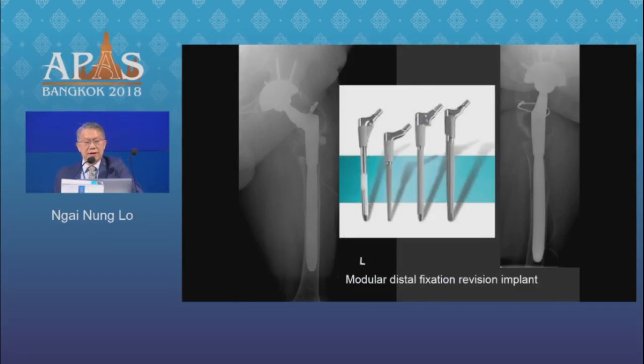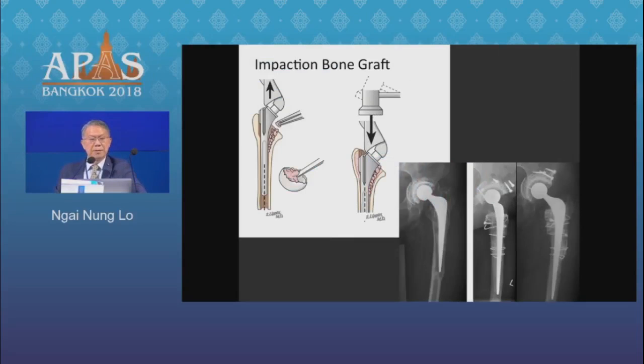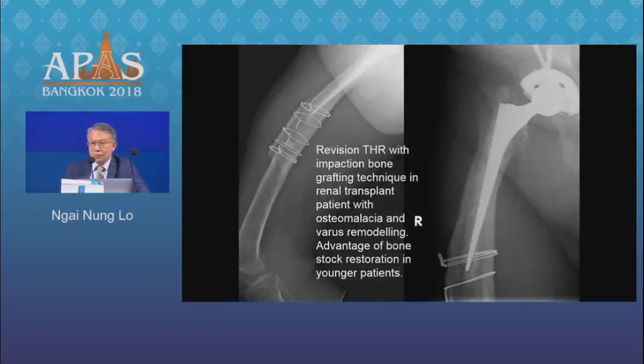So there are many variants of this. They come in scratch fit types, cylinder types. They come in modular fluted types, depending on the surgeon's choice. End of the day, the type 4s, by the time you reach type 4s, is really a tough call. And sometimes the philosophy would be, perhaps, to go to a short stem.